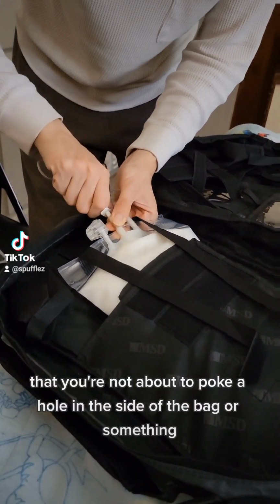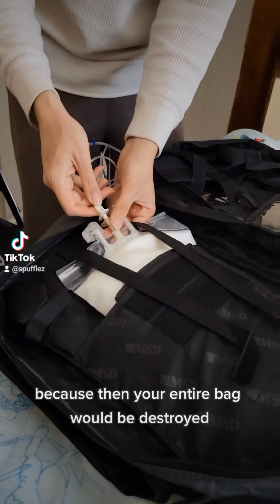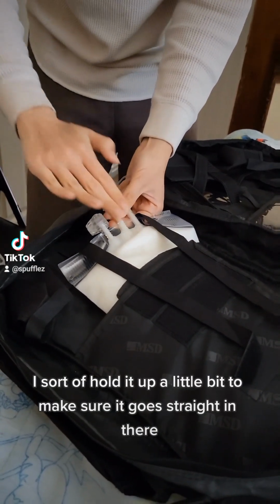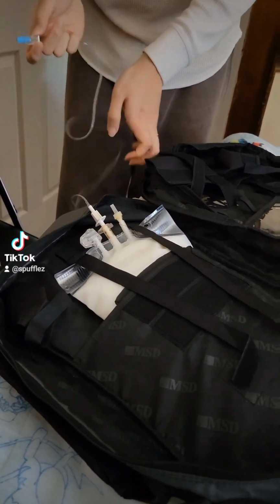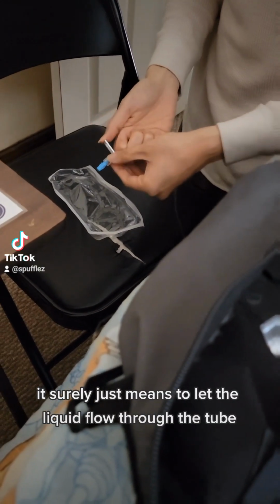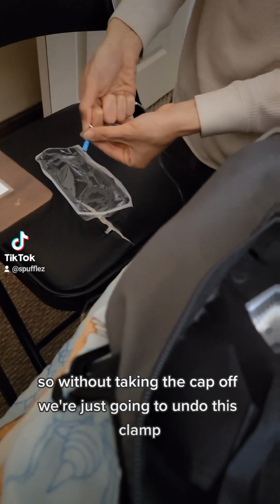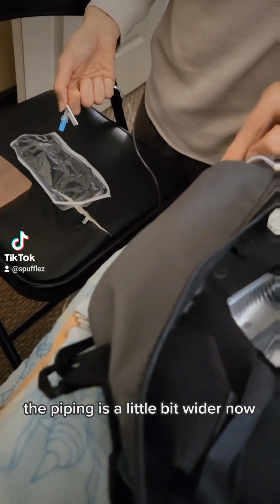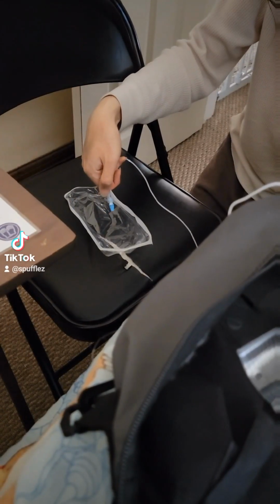And you want to make sure that you're not about to poke a hole in the side of the bag or something, because then your entire bag would be destroyed and you'd have to get another one for the day. Yeah, so as you can see, I sort of hold it up a little bit to make sure it goes straight in there. And then now we have it in. We're going to prime our TPN bag, which really just means to let the liquid flow through the tube until everything looks satisfactory. So without taking the cap off, we're just going to undo this clamp. You'll see here the liquid is flowing through. The piping is a little bit wider now. There we go.